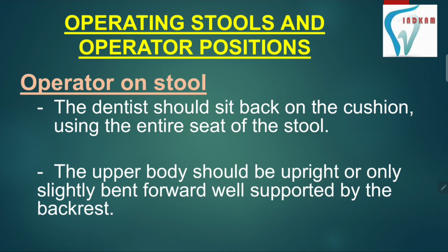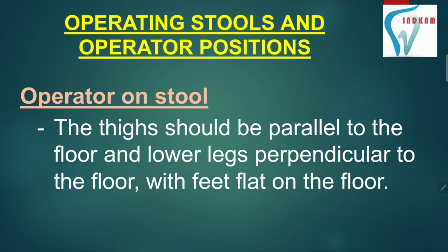So how should the operator sit on the stool? The dentist should sit back on the cushion using the entire seat of the stool. The upper body should be upright or only slightly bent forward, well supported by the backrest. The thighs should be parallel to the floor and lower legs perpendicular to the floor with feet flat on the floor.